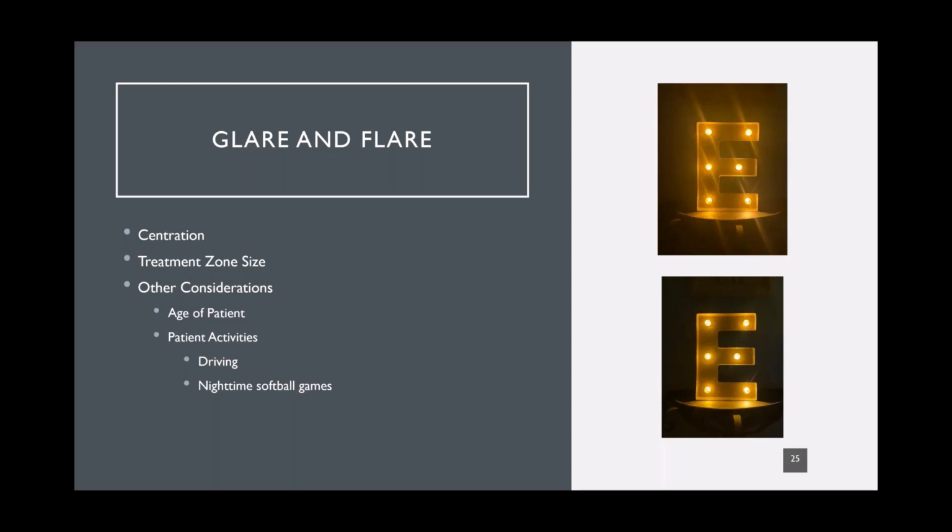I do have a couple other common pitfalls that I would like to talk about before we get to the question and answer period. And here I have just highlighted glare and flare. So sometimes glare and flare is a problem that is caused by a centration issue. Sometimes it's caused by the treatment zone size. And we kind of have to look at the patient overall and see what are their needs.